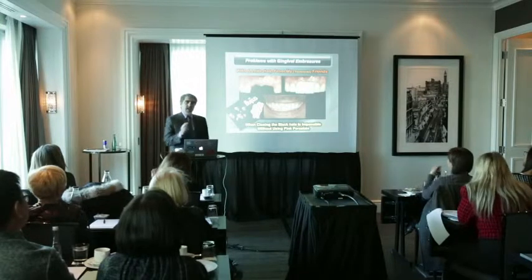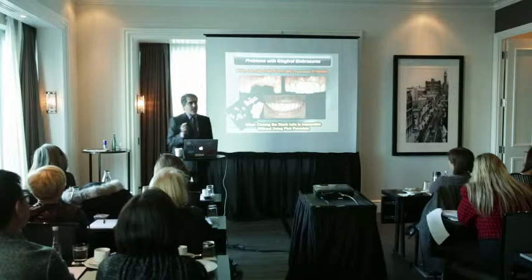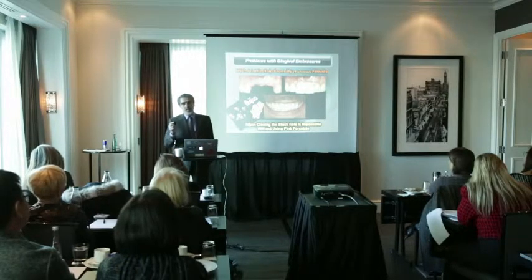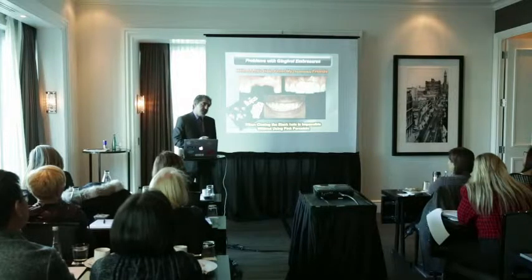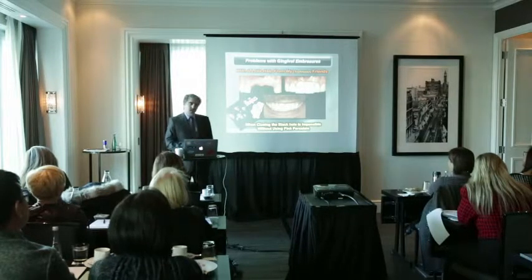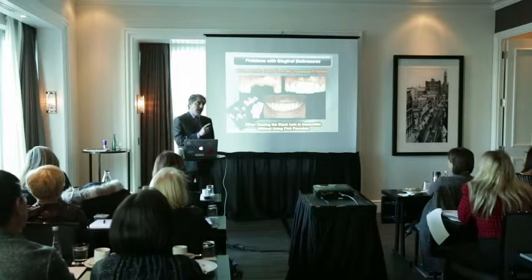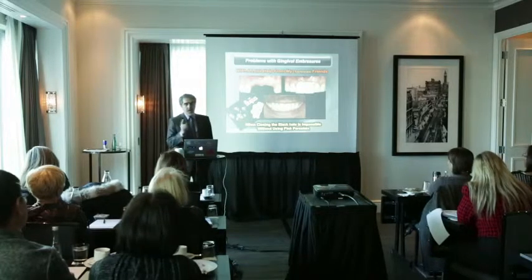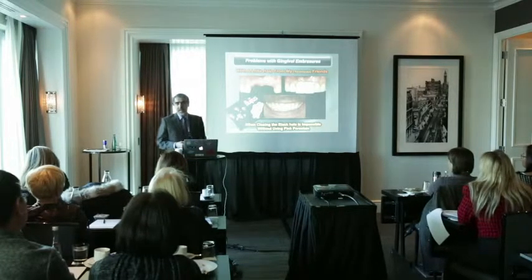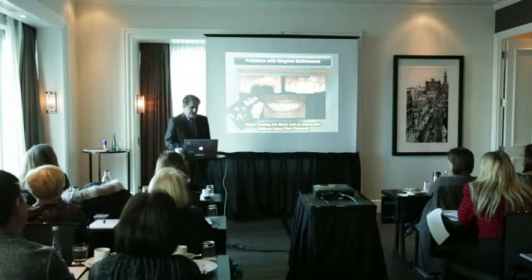So altogether, to avoid these sort of complications, prognosis is very important. You have to evaluate the smile line of the patient, the amount of bone lost, which tooth is missing. Is it 2 implants, 1 implant, central, lateral, are the neighbors good or bad, and then based on that you can explain to the patient what to expect.